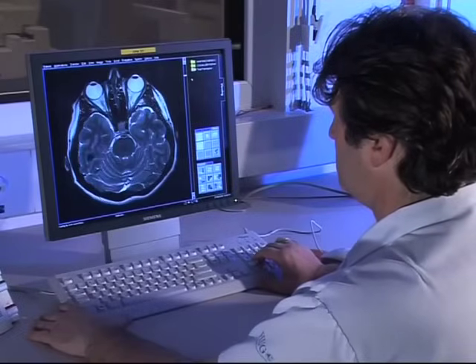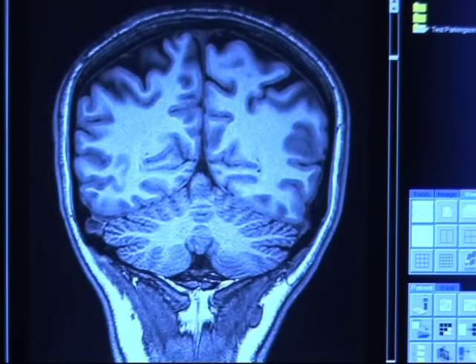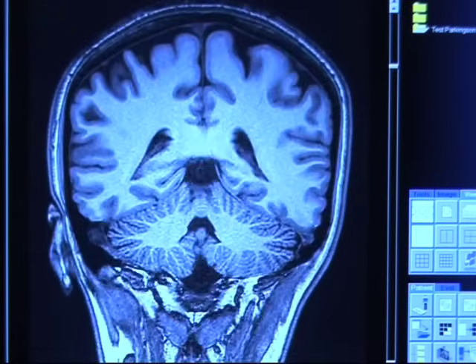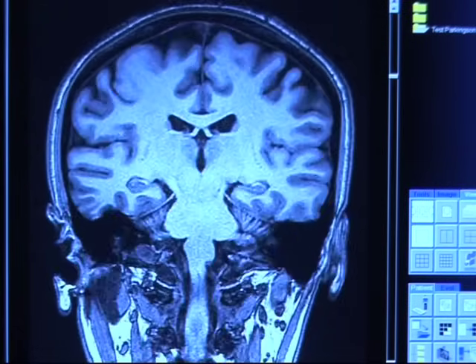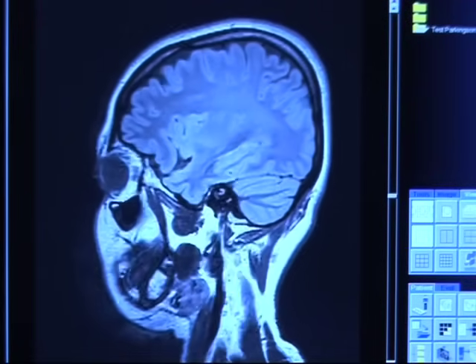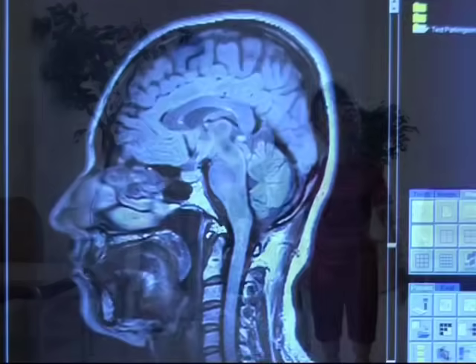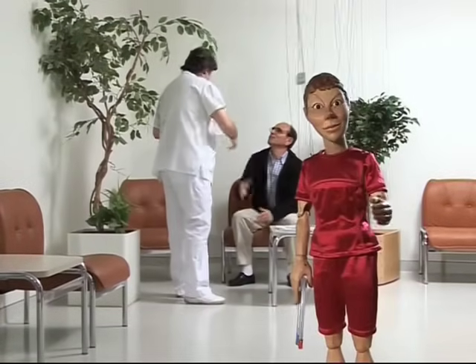I've decided to show you a head scan in this film, but that's just one example. This scanner does not use X-rays, but a powerful magnetic field, like a giant magnet. We will use various settings to highlight details in black or grey or white. It all depends on what we are looking for.